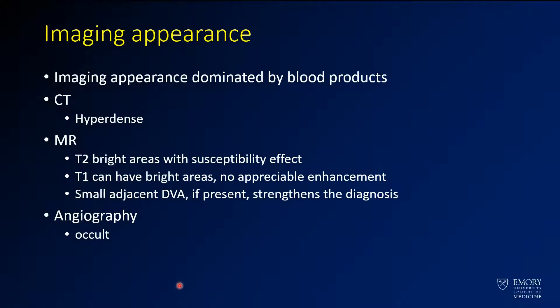The imaging appearance is dominated by blood products. On CT you can have hyperdensity; on MR you have centrally T2 bright areas with surrounding areas of darkness or susceptibility. When you have solitary cavernous malformations, they're often associated with DVAs, or developmental venous anomalies — if you see that, it strengthens your confidence that you're looking at a cavernous malformation.